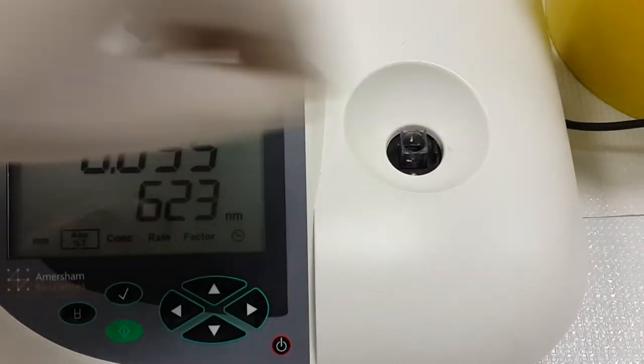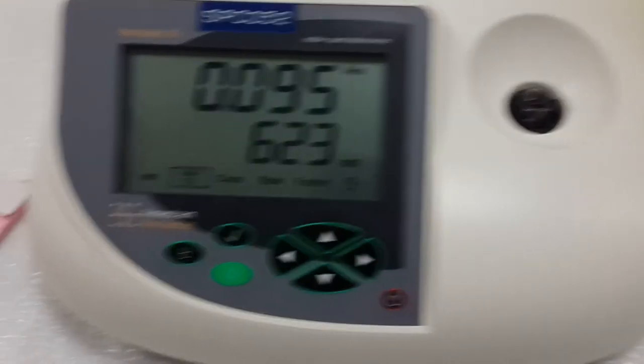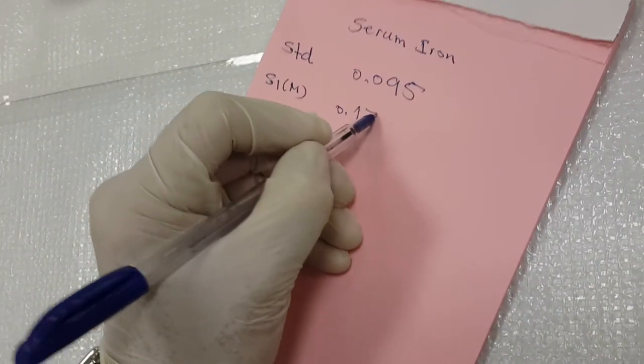Go to sample 1, which represents male sample, and press the green button. 0.170.